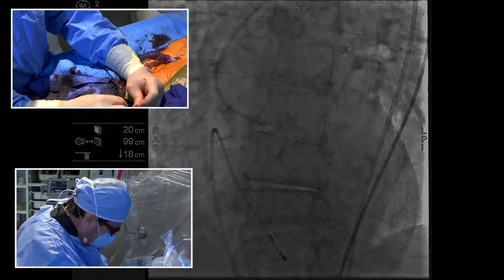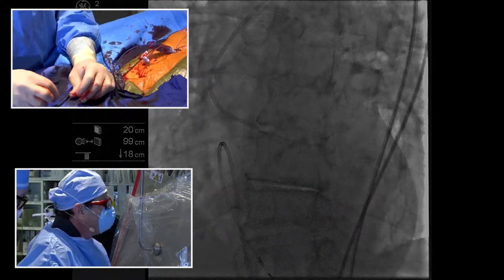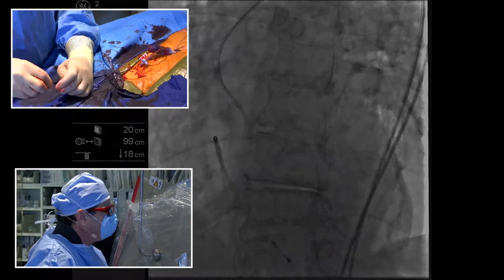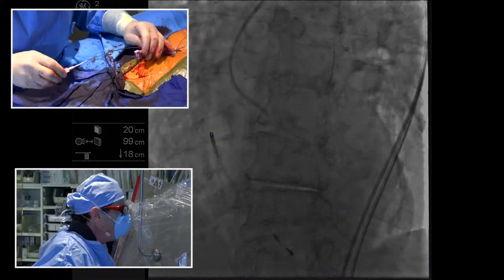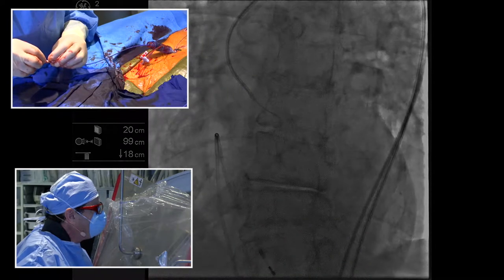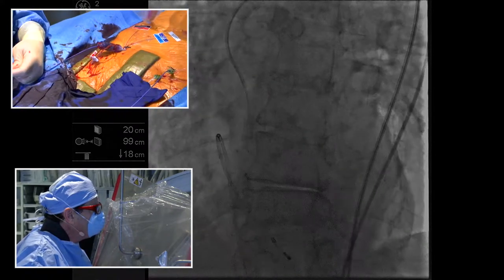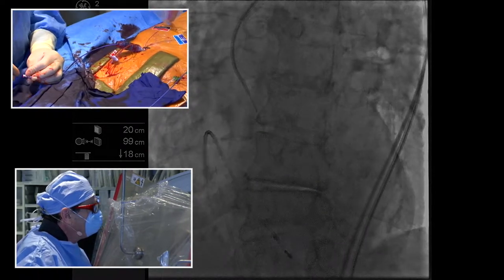And as you can see, all right, I may need some gauze on this. And you guys are getting to see, this one's a little harder to see. Do you notice that? You might even not see it as well, so that'll make it even more boring. You can get the JR4 whenever you want. Okay, good. You got the JR4 on the table? Yeah. Wow, this is not easy, guys. Oh, come on. You can curse at it, too.